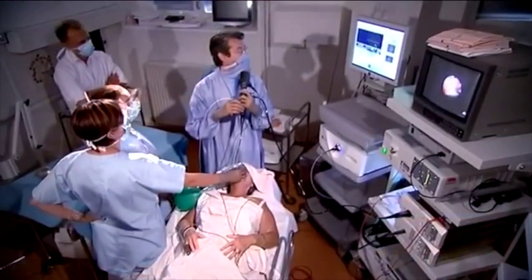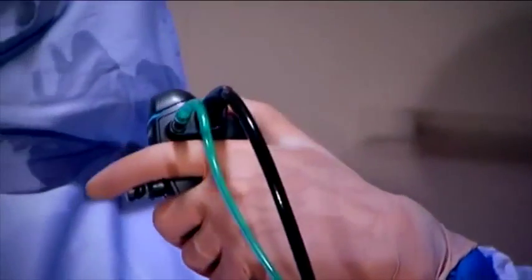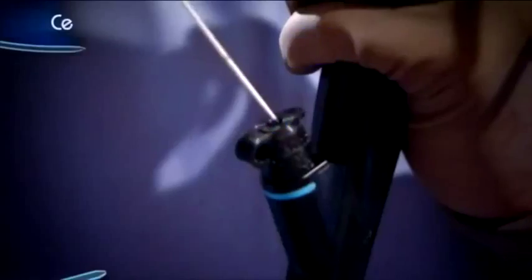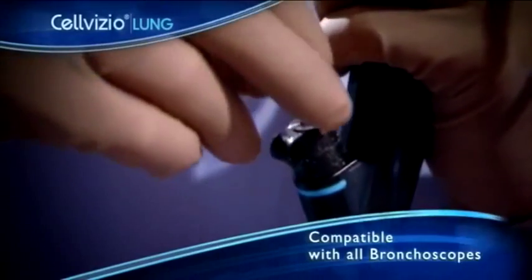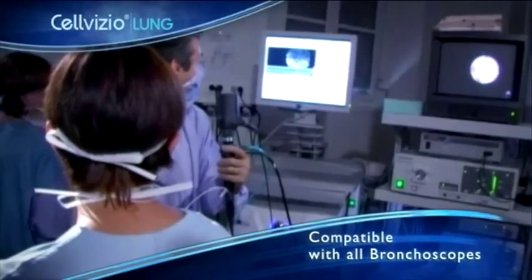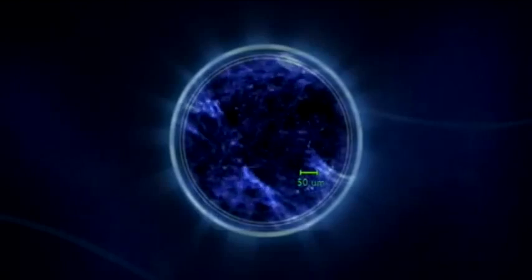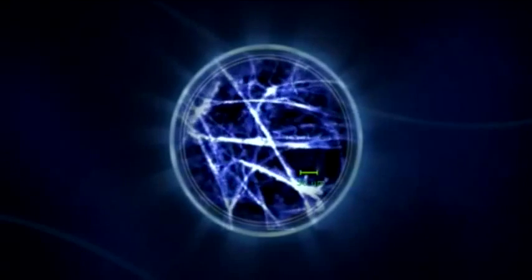The alveoscopy procedure requires only brief training. No additional preparation of the patient is needed. The AlveoFlex is compatible with all manufacturers' existing bronchoscopes operating channels. The potential for current and future applications are immense. A whole new world in pulmonary imaging is unfolding.